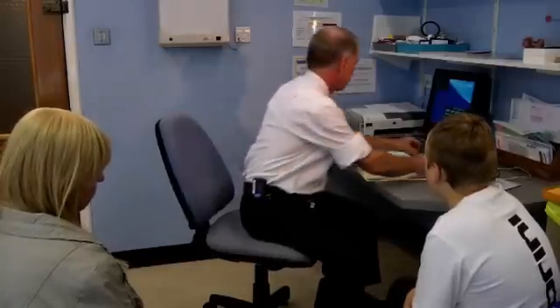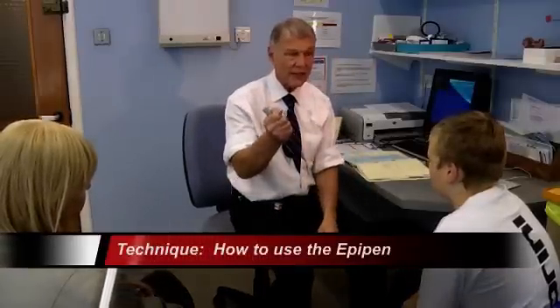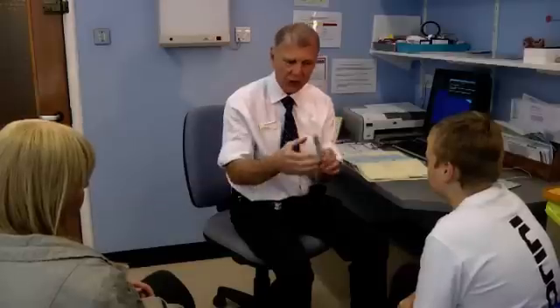Now I'm going to show you a trainer practice pen, which looks like this. This hasn't got any adrenaline in it or a needle in it, so we use it for practising how to do it properly. The first thing to tell you is that when you hold the pen, you hold it in a fist. A lot of people think they need to use their thumb, but you don't — just hold it in a fist like that.